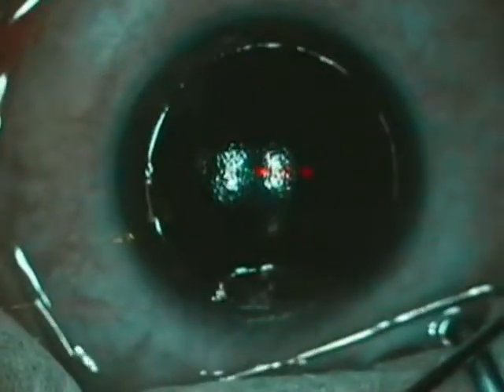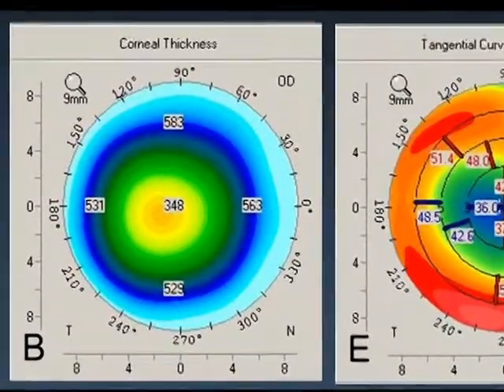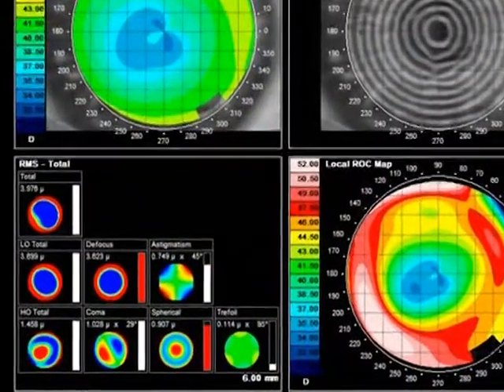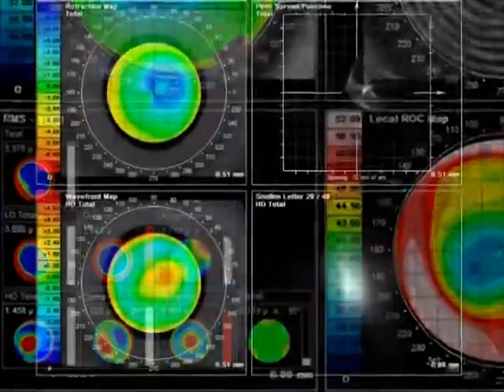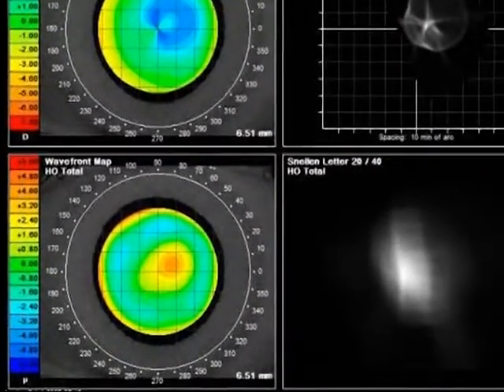This case is a 46-year-old female patient who had a flap complication during LASIK surgery in her right eye. It required 3 retreatments. In contrast, her left eye had a relatively satisfactory result after LASIK surgery. In her affected right eye, central cornea thickness was 348 microns, and a total wavefront analysis obtained by a ray tracing system of individual points revealed residual hyperopia with astigmatism and high levels of high-order aberrations. In the affected eye, uncorrected visual acuity was 20/200 and best corrected visual acuity was 20/70.